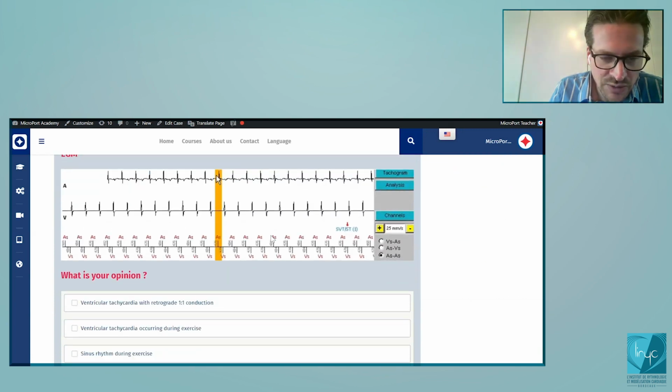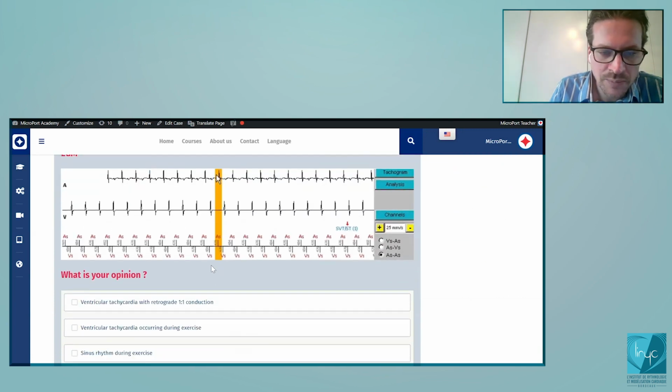So if you look at the EGM, it just confirms what we've been thinking. We have atrial markers, ventricular markers, and as you know, 6 out of 8 in the slow VT zone will trigger the analysis of the tracings and therefore the discrimination algorithm. And in this case, it concluded that it's a supraventricular tachycardia, type sinus tachycardia. And how does that work?